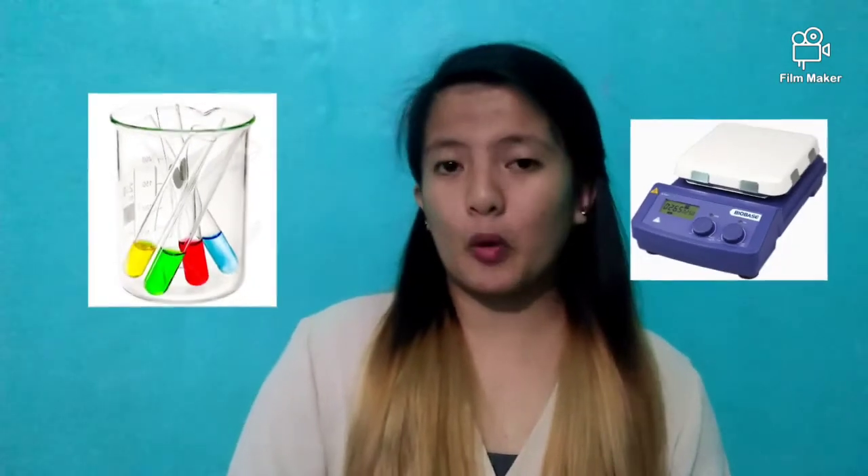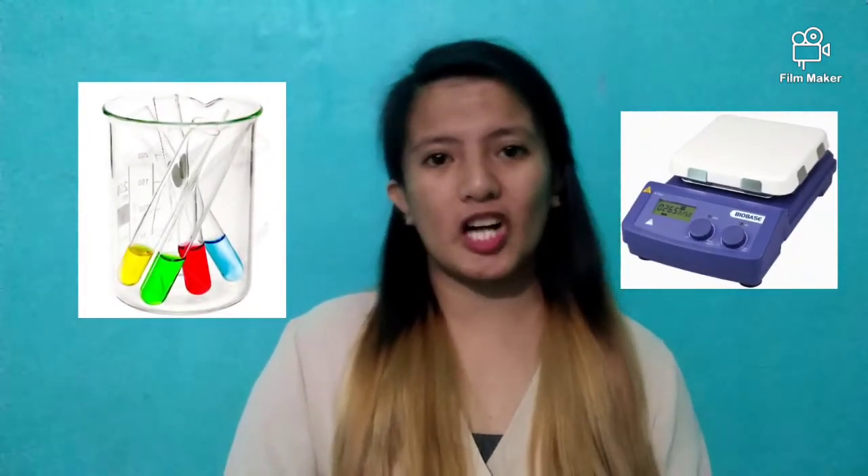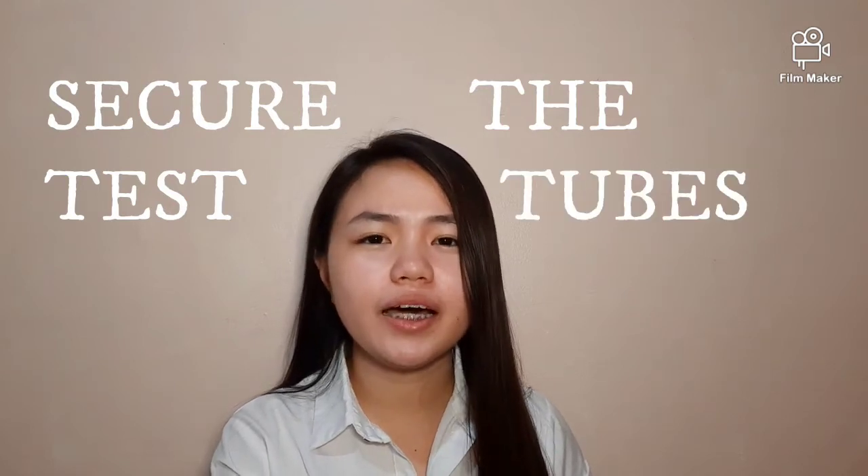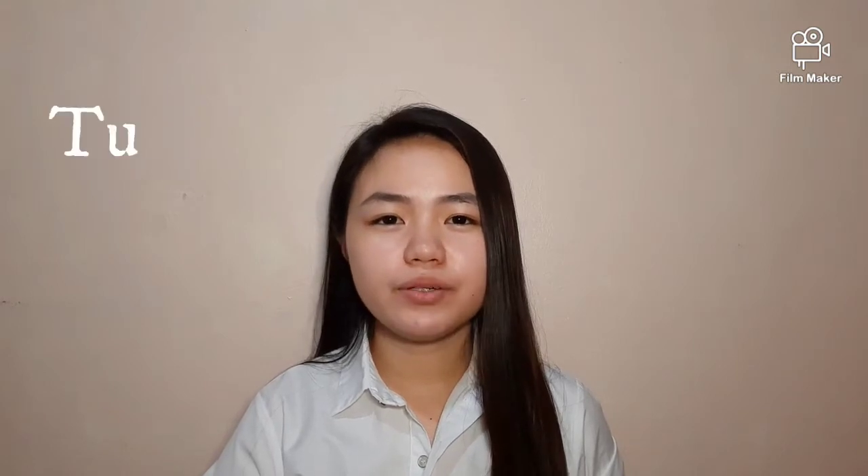Place the tubes in a beaker of distilled water on an electric hot plate and mount a thermometer in the beaker to monitor the temperature. Switch on the hot plate and make sure the test tubes are not moving to avoid uneven heating. Then observe for turbidity. If Bence-Jones protein is present, at least one tube will develop turbidity at 40 to 60 degrees Celsius.